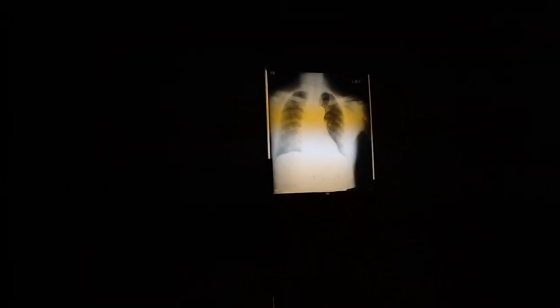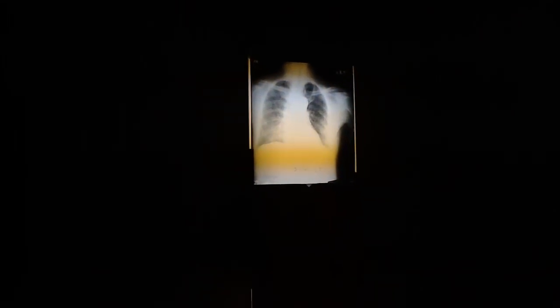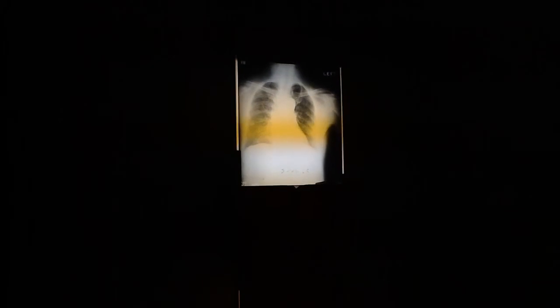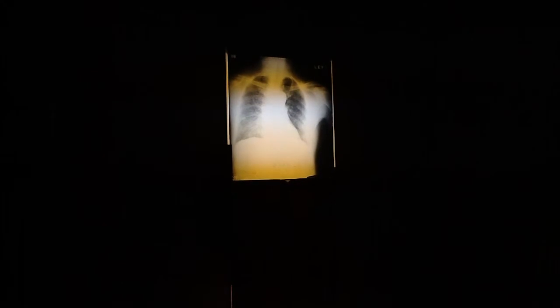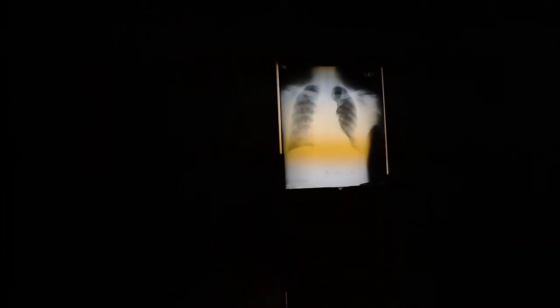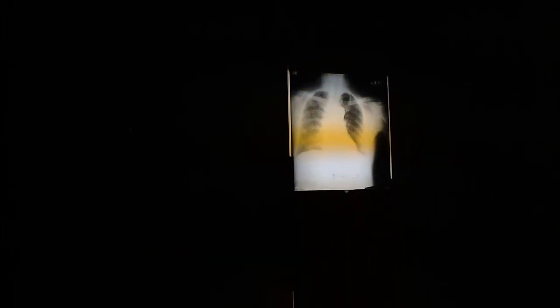The textbooks don't do that. The textbooks just bundle it all together. They say anything that's 5 or less, including even the acinar shadows if they're small size, is miliary. We split them out into these different sizes just because it's easier to learn them that way. They basically say you've got big nodules or you've got small ones, and small ones are anything that's miliary, 5 or less. Well, we might as well split them out and talk about them as different nodules, because I think it's easier to learn them that way.